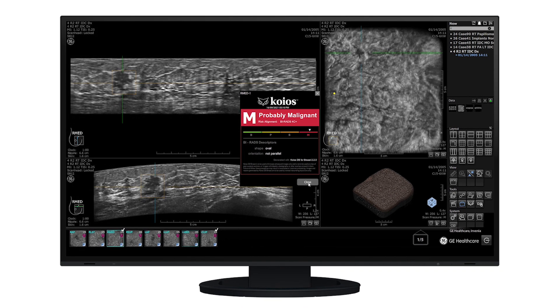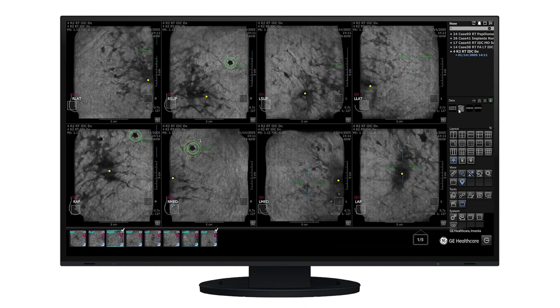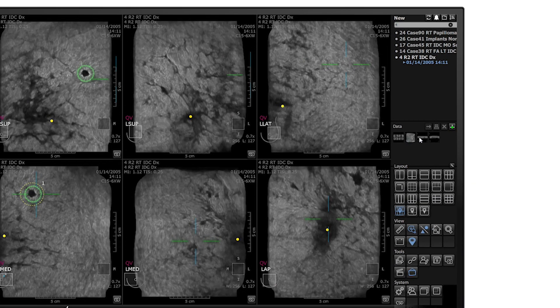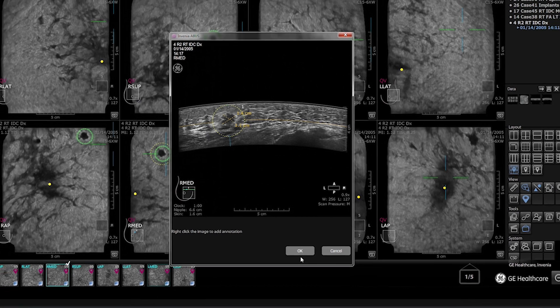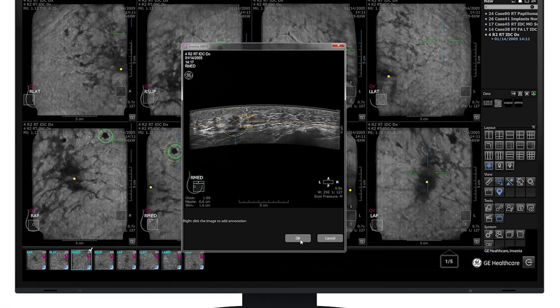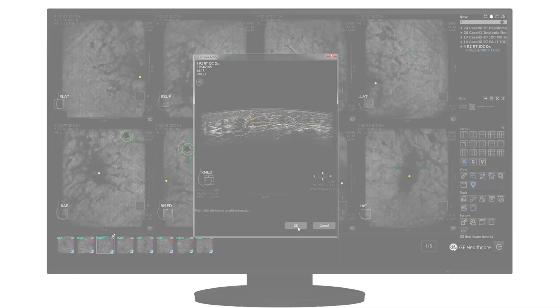With a QView CAD and Kios DS Breast recommendation, users can place markers to have screenshots sent automatically in a DICOM format to PACS to complete the review documentation.